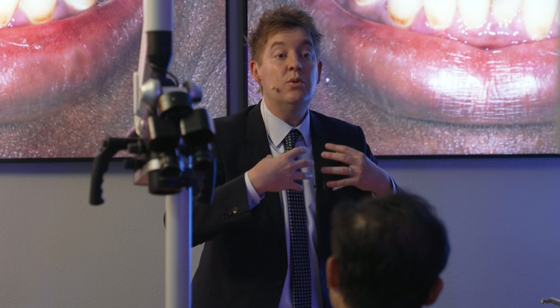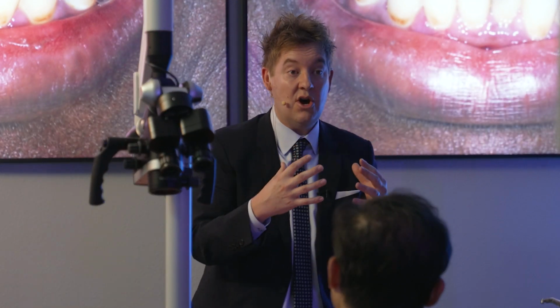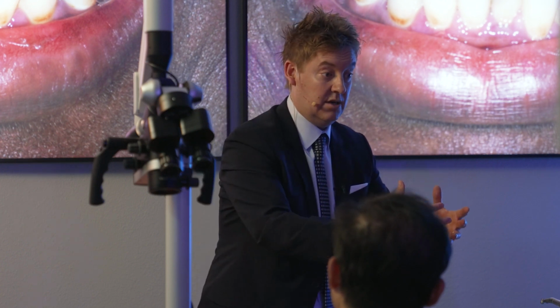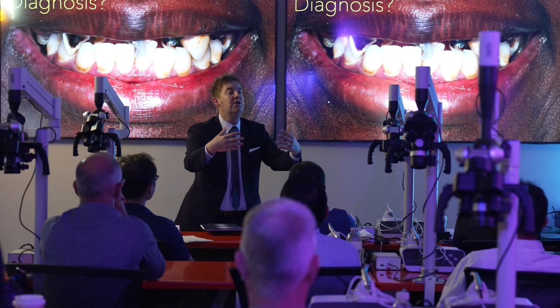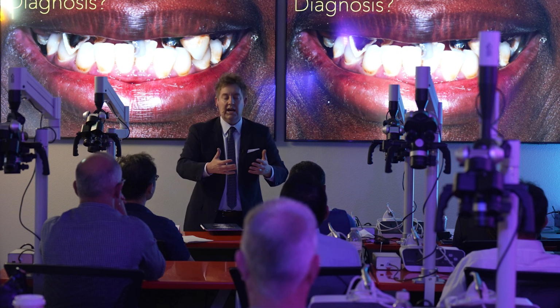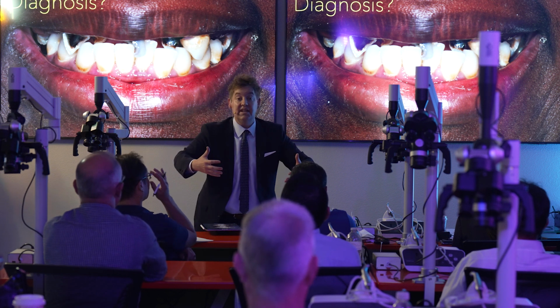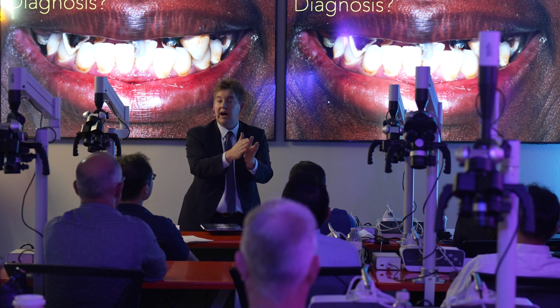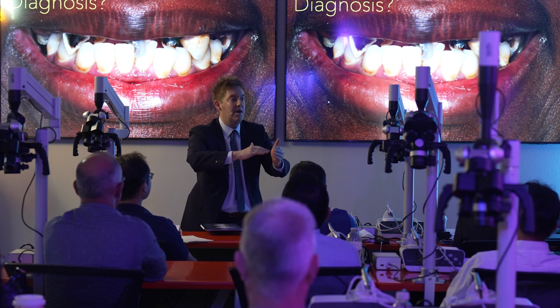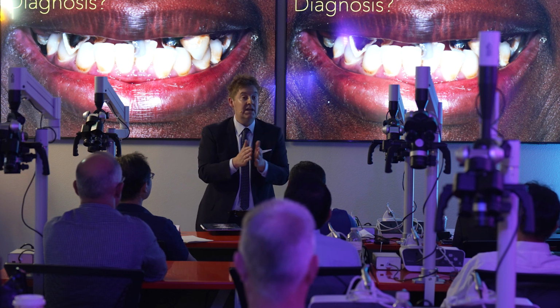So recognize that we use our own images initially to help us understand what is going on, and then we translate that to the patient. Okay, so our awareness first, and then theirs, and then the case presentation. Let me tell you what I used to do as a very young dentist. I used to bring patients in, and if I recognized that they needed a lot of dentistry, occlusal therapy or full mouth dentistry, I would get alginate impressions, maybe a face bow, maybe centric relation bite records. I would take all these images. I would say to the patient, there's a lot going on.